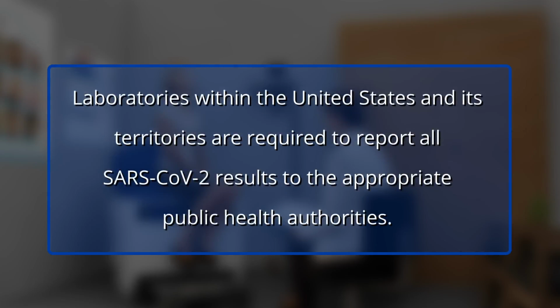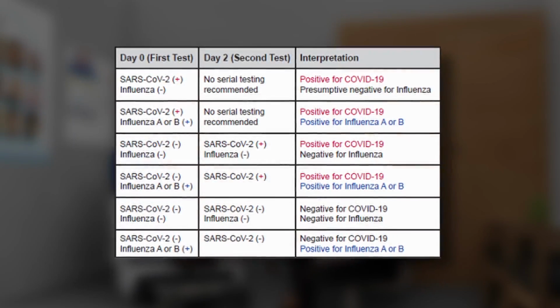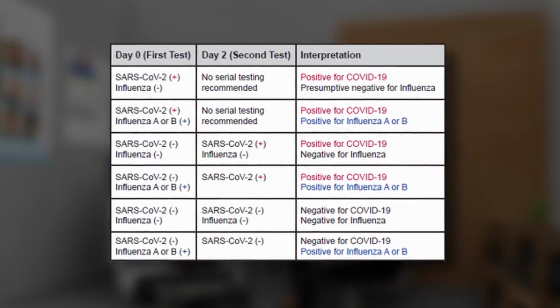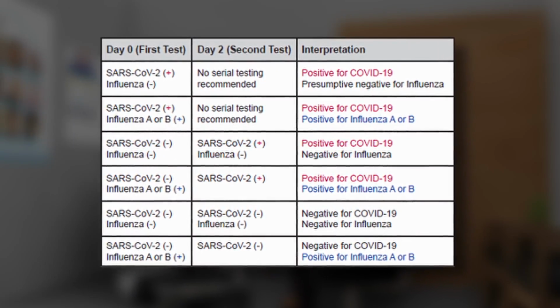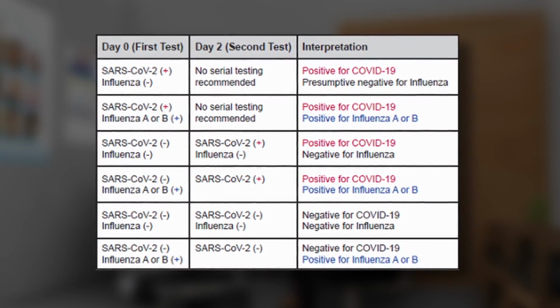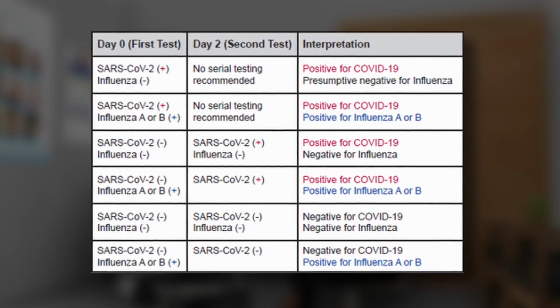Laboratories within the United States and its territories are required to report all SARS-CoV-2 results to the appropriate public health authorities. Serial testing is needed for all samples that are negative for SARS-CoV-2 on the first day of testing, even if they are positive for influenza A and/or B.